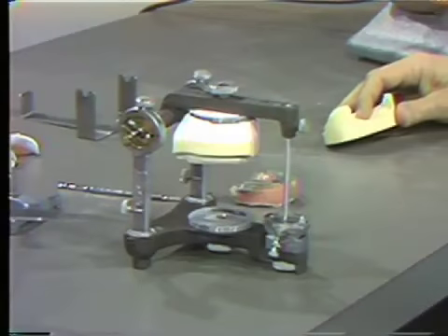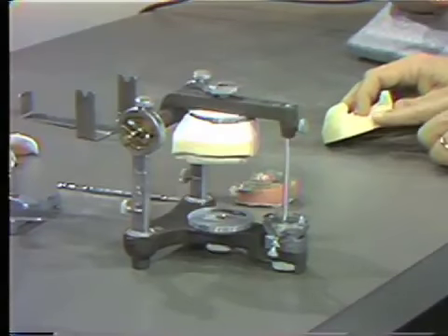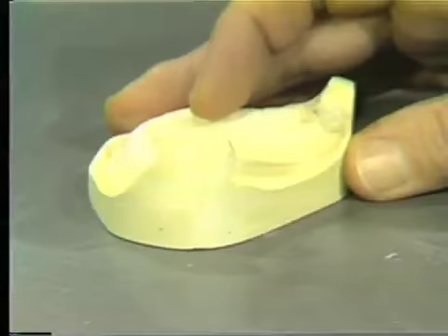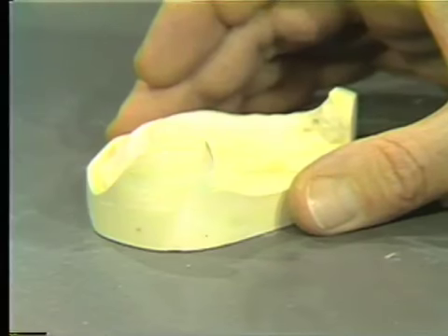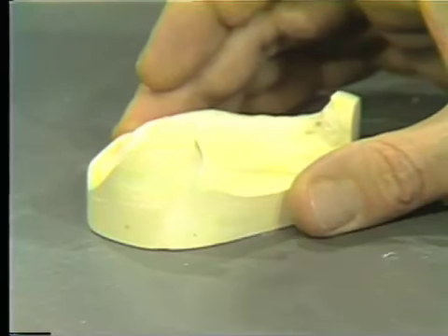Our next step will be to prepare the lower cast for mounting to the articulator. You'll note we will check the thickness of the base. If this exceeds a half inch, we'll put it on the model trimmer and remove some. The reason being that this cast must be prepared so that it will fit into the flask later on, also prepared so it'll fit in accurately and with adequate space into our articulator.